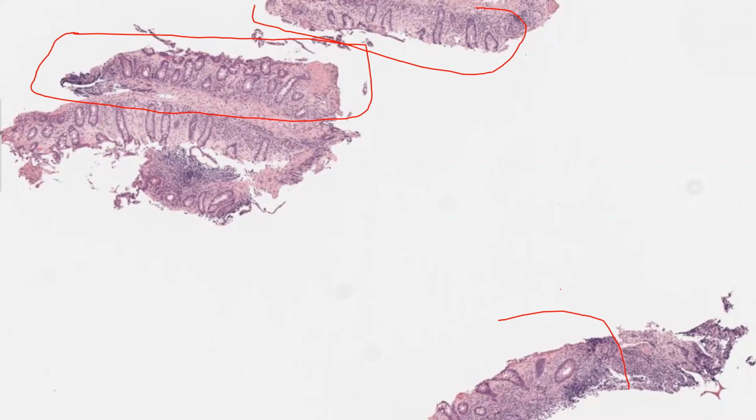And that is the opposite of the norm, because with inflammatory cells, if you don't have inflammation, or even if you have a focal inflammation, the inflammatory gradient will be maintained. So it will be heavier at the top and lighter at the bottom. But what you have here is the opposite. If you don't look at this at low power, and spend your time getting a cup of tea, coffee and biscuits and sitting on low power for 10 minutes first to look and stare, you will miss this. And then you will say that you don't see a proper inflammation.